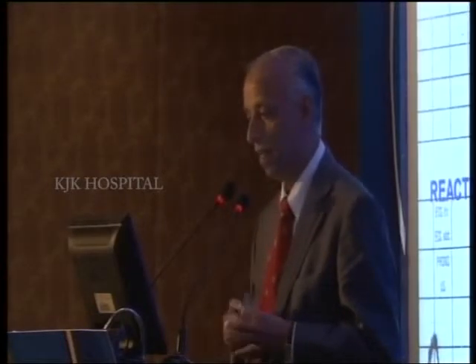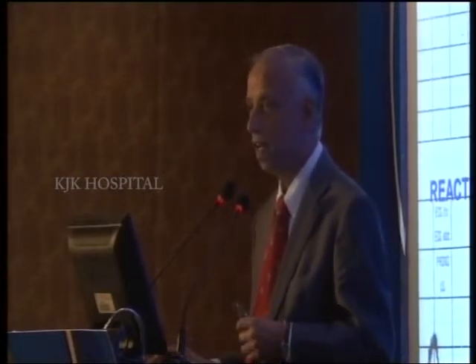This is about CTG, and I was just talking to Professor Piley about whether you all use CTG, and he said yes, it's frequently used, so it might be quite easy for me to go through. Now, CTG is actually cardiotocograph.